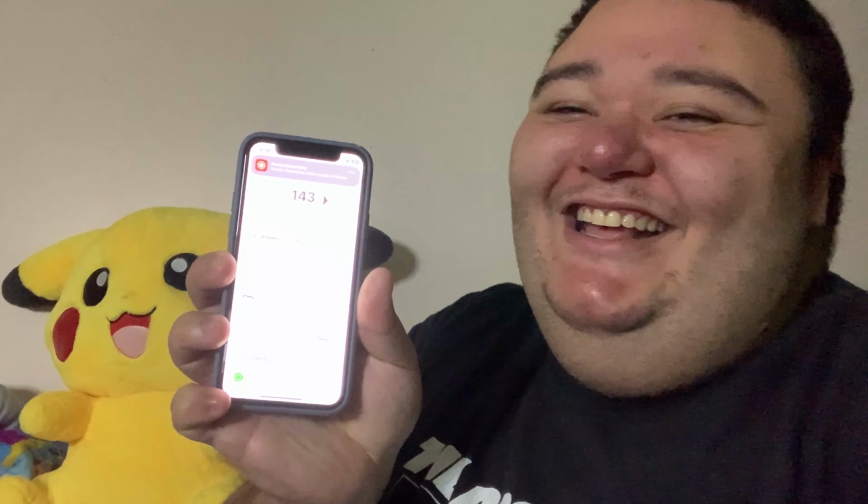Now I'll be able to start reading my blood sugar, and you guys will see it here. That's why you see the screen recording, because you see all the fun stuff while I'm waiting for the warm-up process too. Well, guys, I hope you enjoyed me putting a new G7 sensor in and getting ready to go. That was my last box, actually.